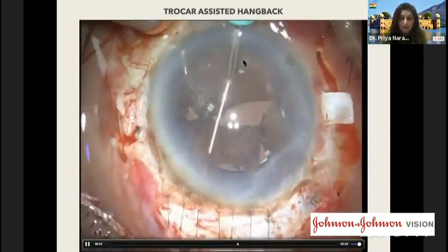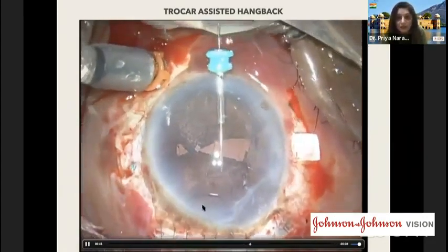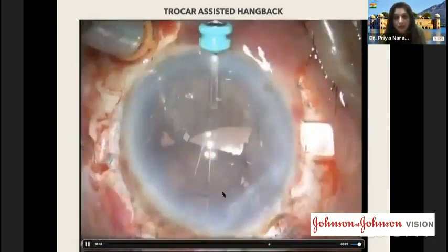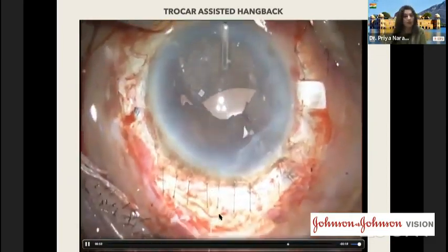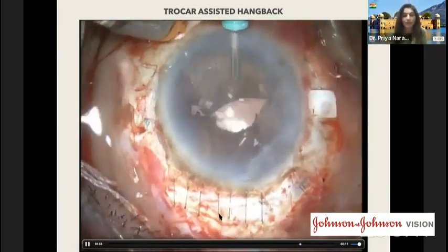So now this is the clinical video. What you're seeing here, the double arm suture is sliding. The first suture has passed on. This is the second thing that is going inside, and this is the second arm. So now you can see how it slides inside. The loop goes inside, and then from your tunnel, wherever you have created, it comes out. And then you can just titrate the amount of tissue that you really want to pull.